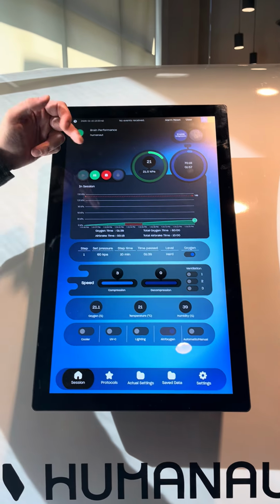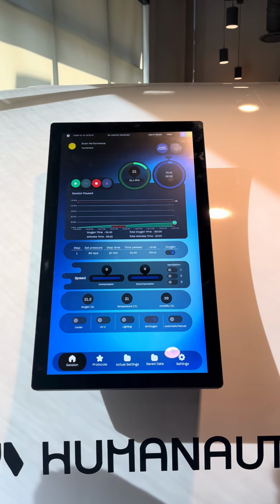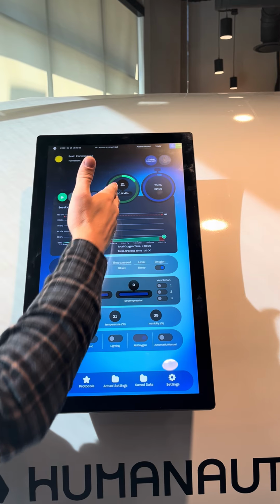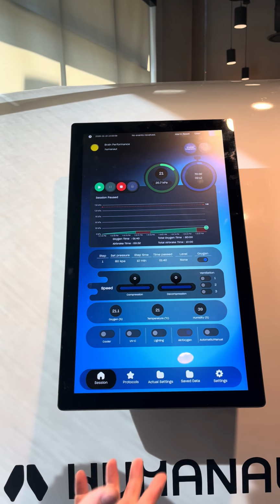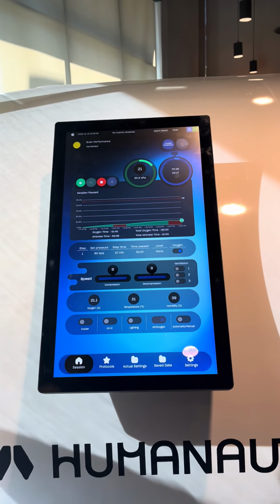Okay, so we've hit our 20. It's 2 minutes. That timer is going to keep running, so that's not a true 10 to 10 or 1 to 10. Okay, how are you feeling? Are your ears clear? Okay, let's keep compressing.